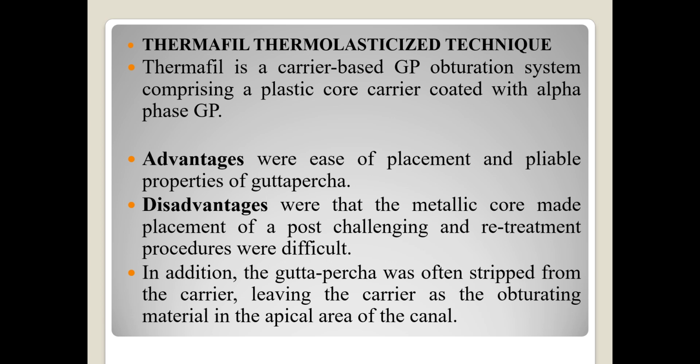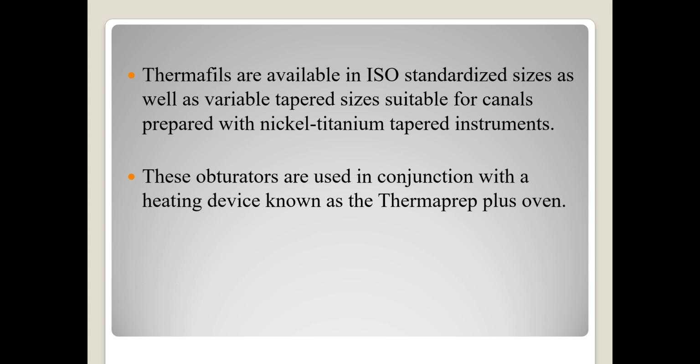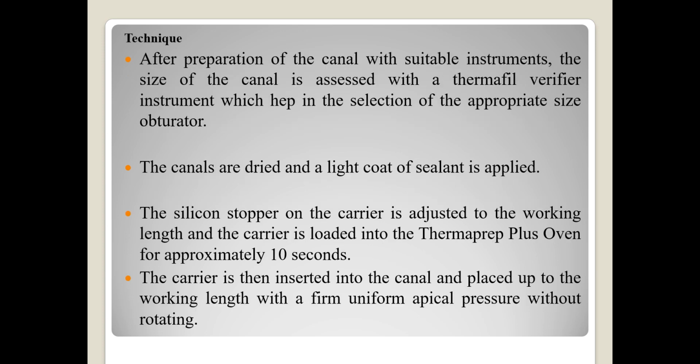Disadvantages include that the metallic core makes placement of a post challenging, and retreatment procedures are difficult. In addition, GP was often stripped from the carrier, leaving the carrier as the obturating material in the apical area of the canal. Thermafil is available in ISO standard sizes as well as variable tapered sizes suitable for canals prepared with nickel-titanium tapered instruments. These obturators are used in conjunction with the heating device known as the ThermaPrep Plus oven.